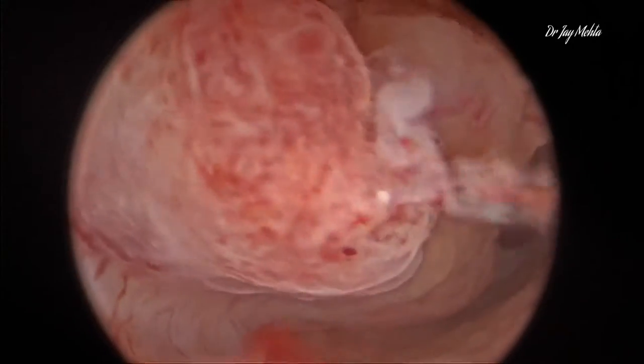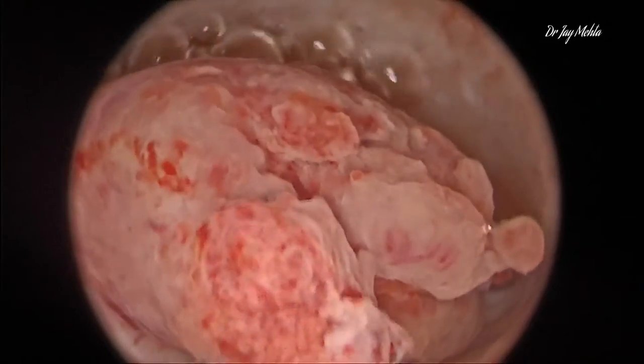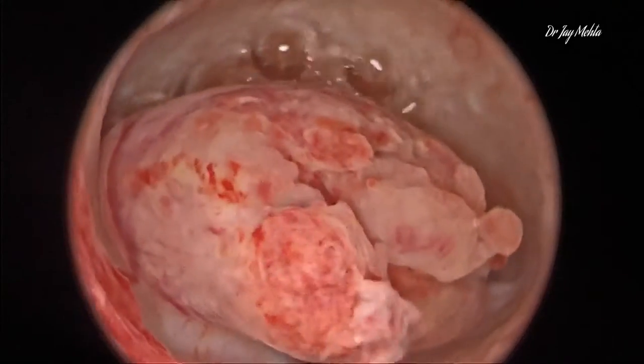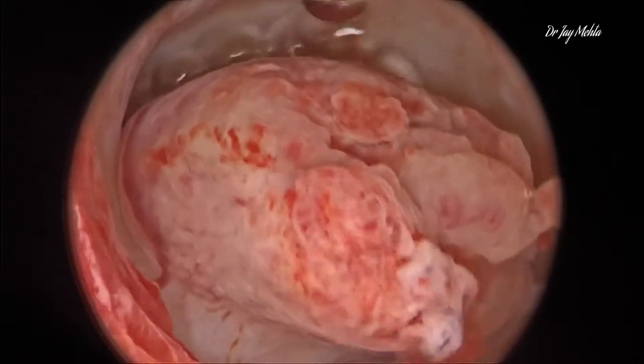You can see that there is a polyp inside the cavity which is very unhealthy. The tip of the polyp especially is very unhealthy. Biopsy needs to be taken from this entire polyp. It is very difficult to extract this entire polyp out because simply of the size, the base of the polyp is very wide.